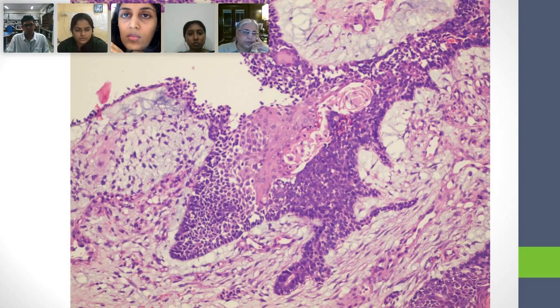Okay. So now, do you see some cellular atypia here? Yes, ma'am. So what do you mean by cellular atypia? Hyperchromasia, enlarged nucleus, high NC ratio. Hyperchromasia, hyper means more, right?